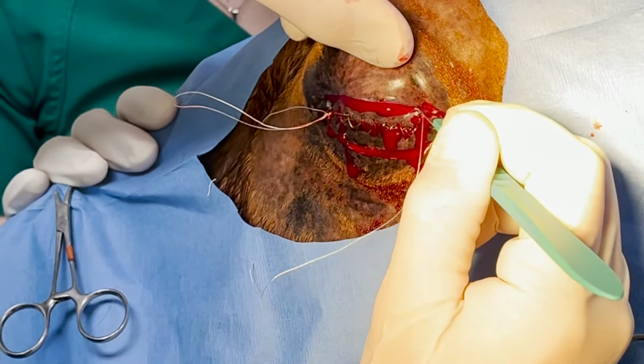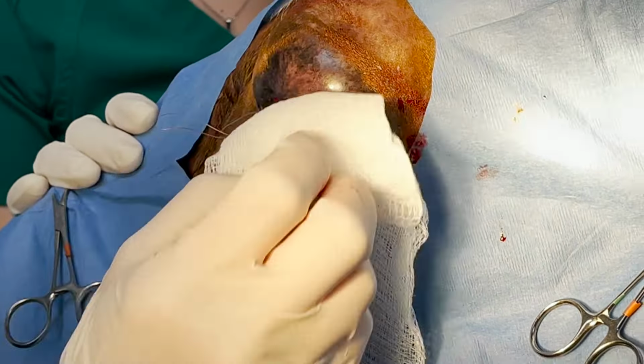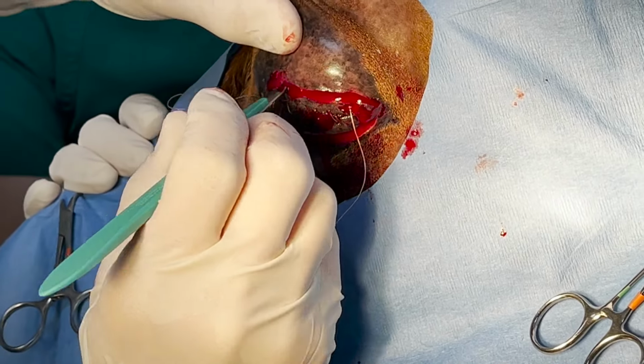So that gives us our windows to get back to the tissue to cut. There's a lot of muscles that surround the eye and that are attached to it, and that's how we're able to move our eyes in every direction. So we'll be cutting through the muscles and the other connective tissue in there.